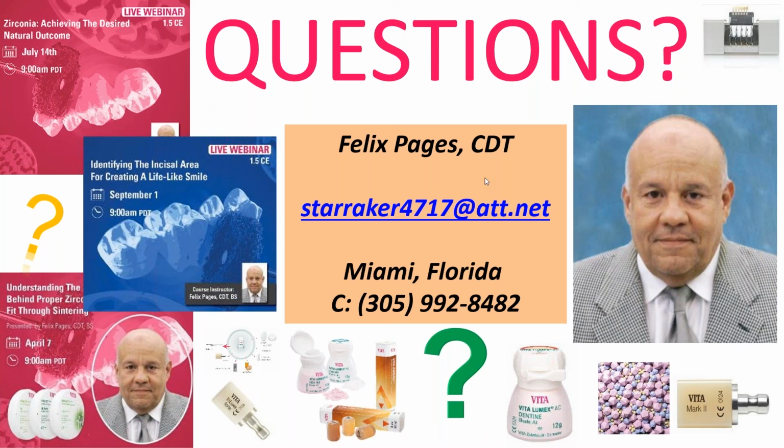So we prefer to have a decent multi-layer zirconia so that the occlusal table rests where the enamel should be. And then on some cases, maybe we'll do that next year. And I use some color on the inside of the fossa to pigment the fossa. That way I have a light-dark contrast and the fossa looks deeper. Because if you just have regular color the same, every cusp tip, fossa, everything the same, they just don't look as real. So you need to change that up a little bit, and that's how we do it.